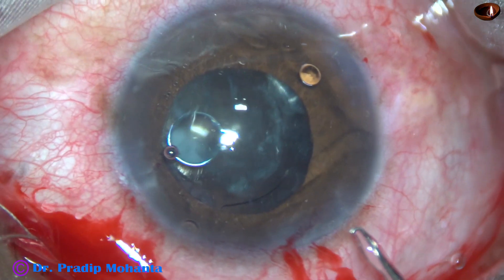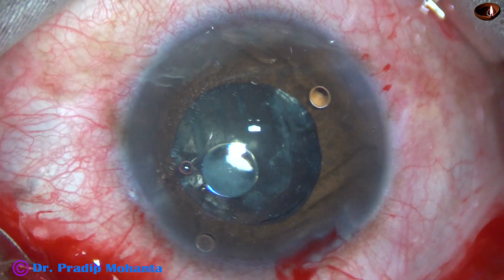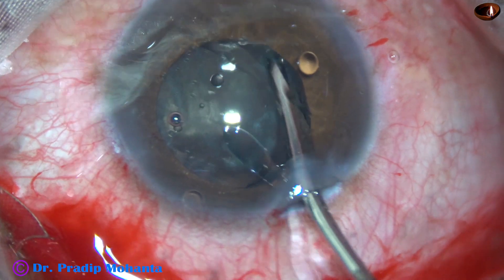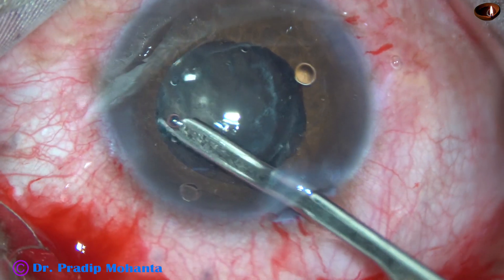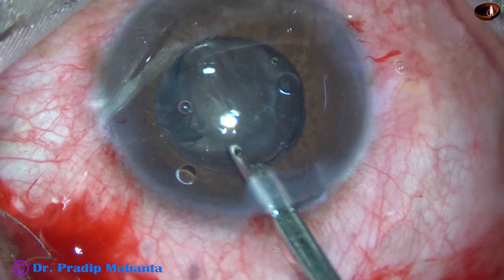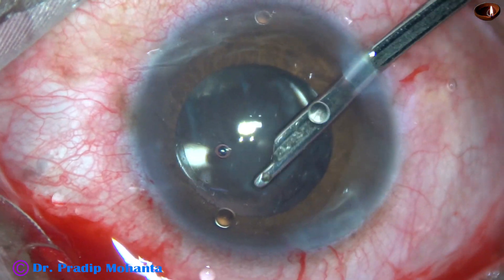The pre-existing PC rent had fibrous margins, so it didn't extend. My vitreo-retinal colleague is going to make a small opening with cutters just behind the intraocular lens and just at the center of the pupillary area, because the posterior capsule is fibrous and it is very difficult to make an opening in this fibrous capsule with a YAG laser.